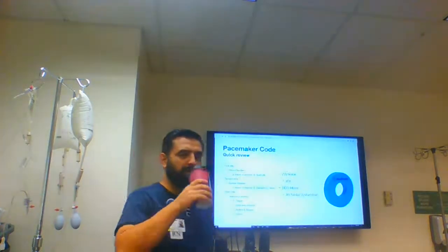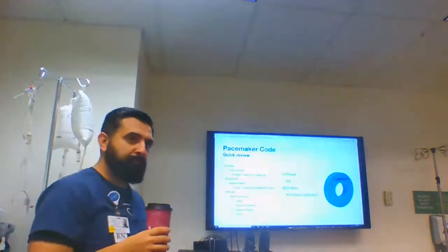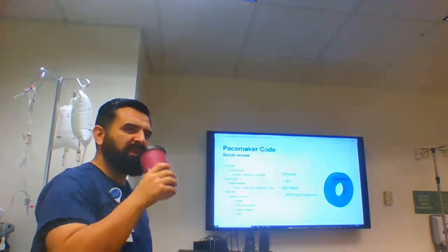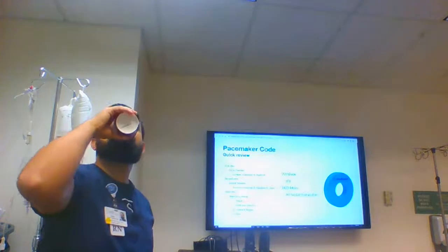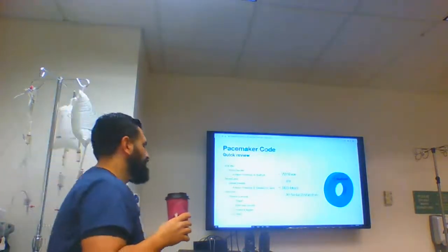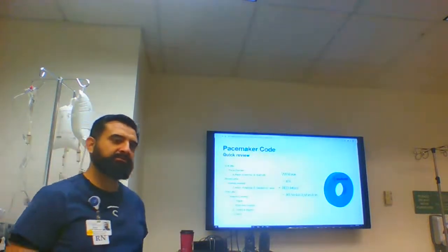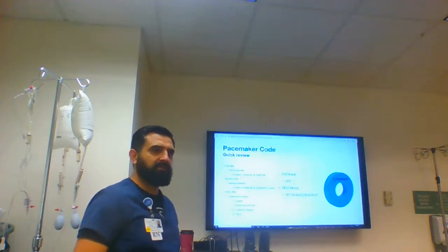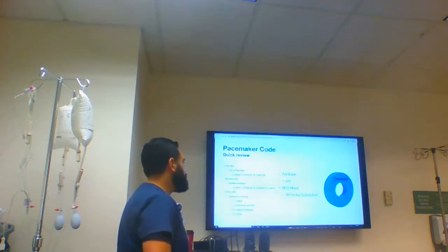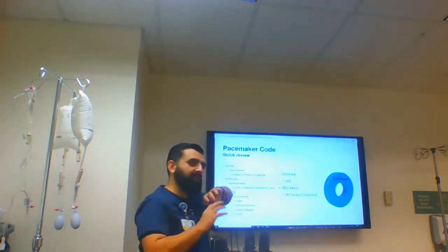How would a new nurse interpret an external pacemaker like this, or internal, compared to a transcutaneous pacemaker that we're using the Zoll with? So I know trigger and inhibit and all that kind of stuff. We can correlate those with what settings on the Zoll monitor, let's say. So like I said, this is just reviewing pacemaker code and not necessarily all pacemakers in general.